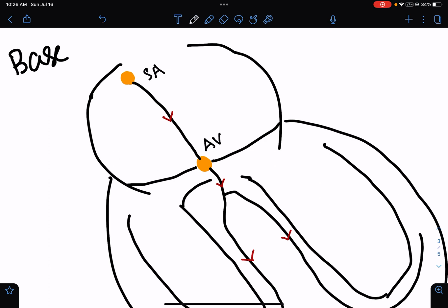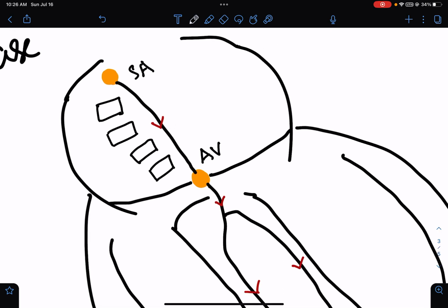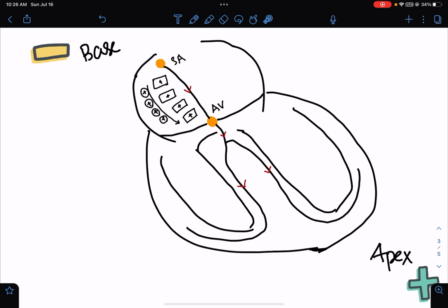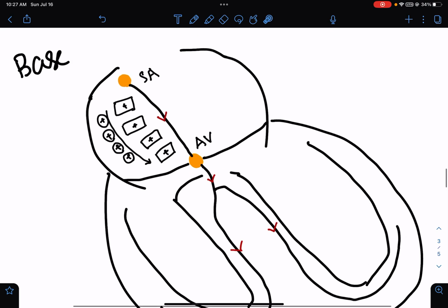If we stimulate from the SA node, there will be action potentials in the cardiac myocyte. That is muscle action potentials. There will be more positive ions in our source, and it would carry the positive vectors here. Positive vectors, positive vectors. If a positive vector moves towards the positive pole, there will be a positive deflection in the galvanometer, right? Okay, so this is number 1.